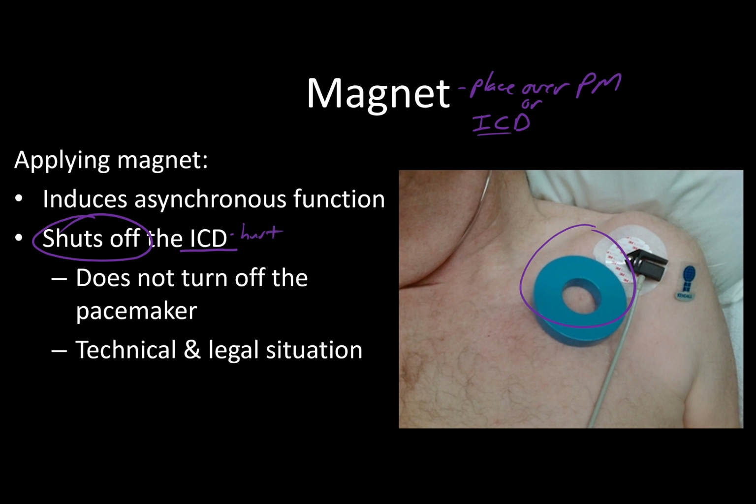If it's going off a whole bunch and it's not supposed to, you do that to help protect the patient. If it's going off because maybe it's an end of life case, that's a great reason to shut it off, because if it's end of life and they're on hospice or something, you don't want them to be shocked if it's unnecessary, because that's not the kind of treatment you want to provide. So those are two important scenarios I want you to keep in mind. But that's for the ICD.